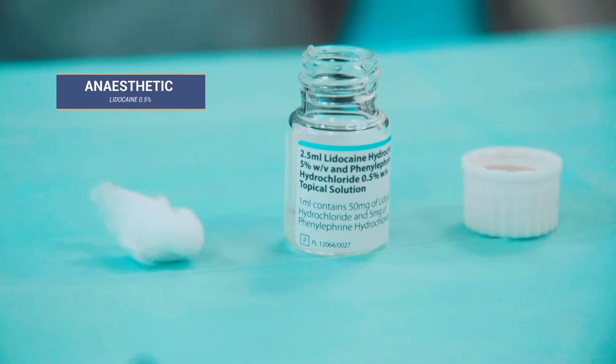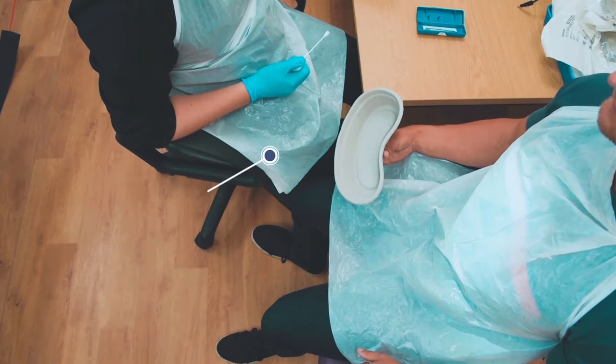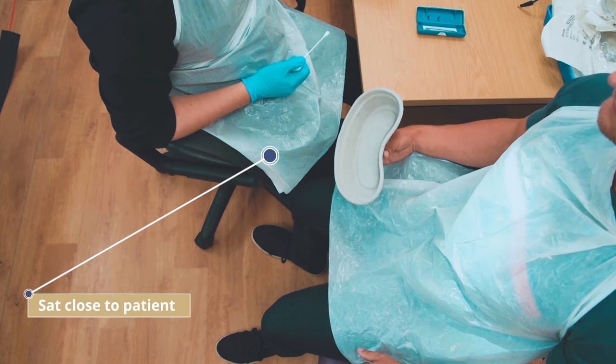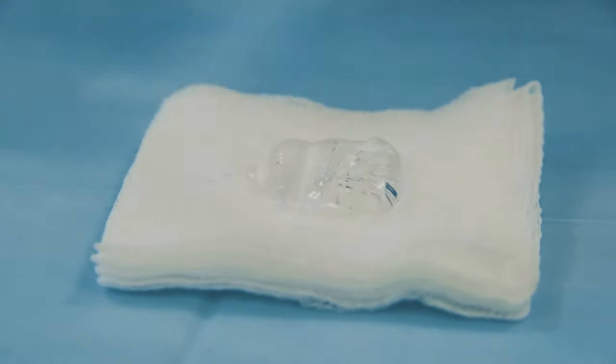Once again, the patient may require anaesthetic. Your registrar will adopt the same position as for anterior bleeding, with good lighting and protective clothing. Shown here are both the right and left handed positions. Once all prior packing has been removed, the procedure can begin.